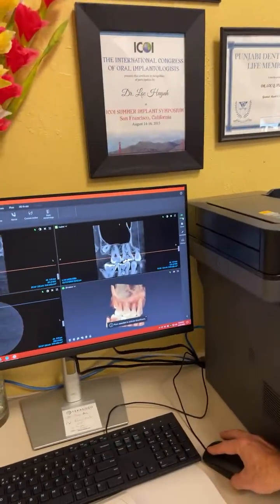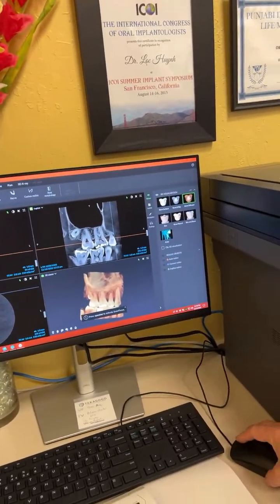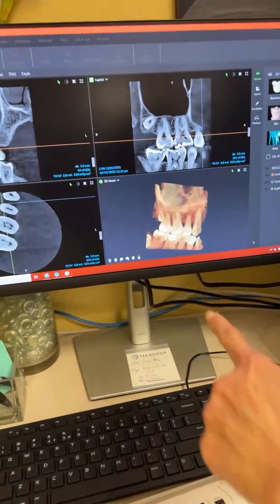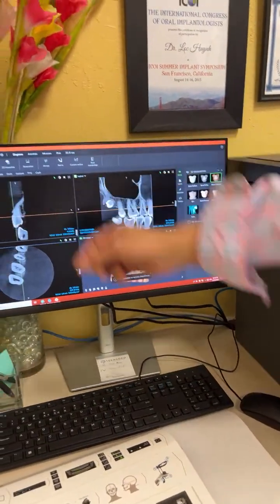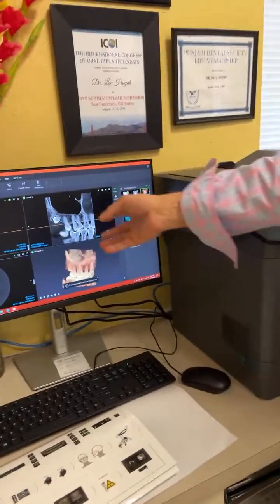Here, the viewer. I'm just showing you this too. See where it says press space bar? Then space bar. If I hit that one, it would focus on that tooth, and it would find anything associated with it. You'd have up to 12 at one time.